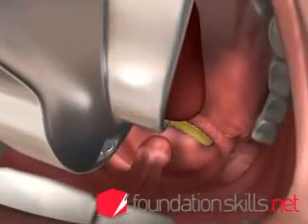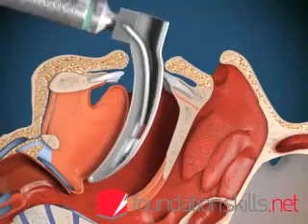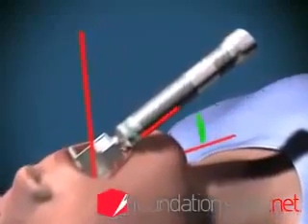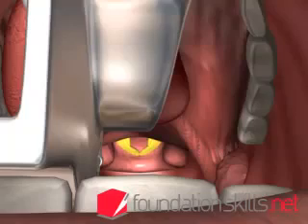the tongue. Advance the tip of the laryngoscope blade into the vallecula between the epiglottis and the tongue. With the handle of the laryngoscope pointing away from you at 45 degrees, lift upwards and away to lift up the tongue and epiglottis to display the vocal cords and the laryngeal opening.